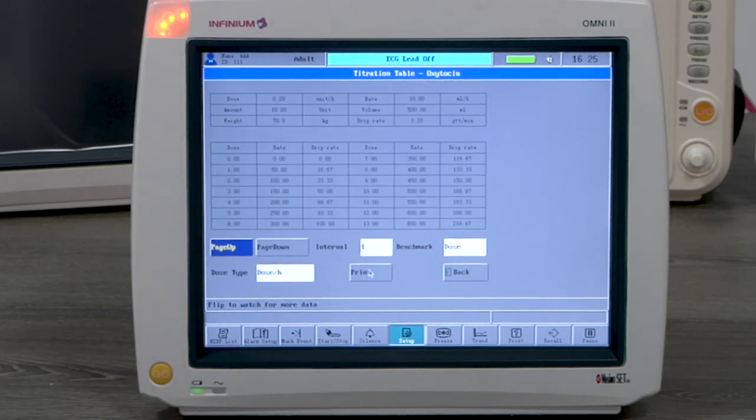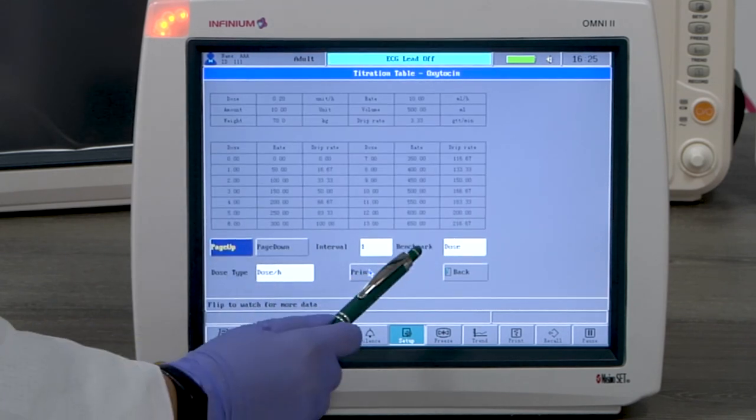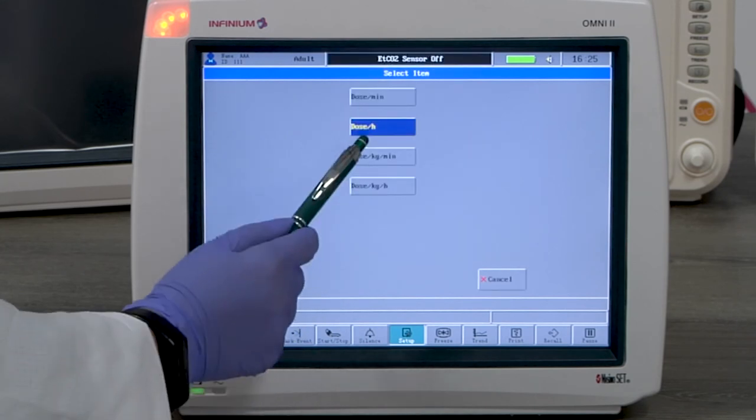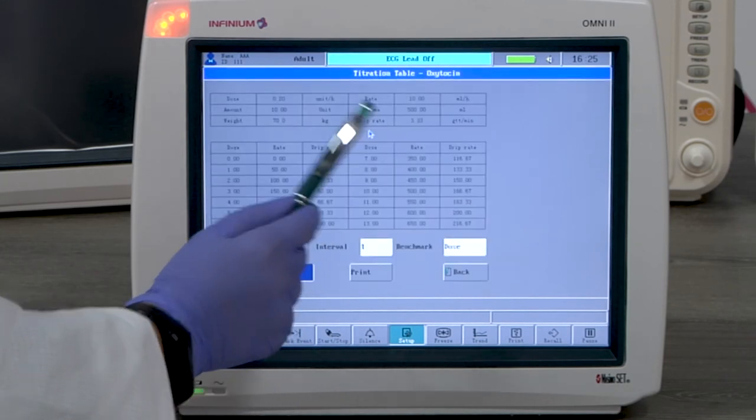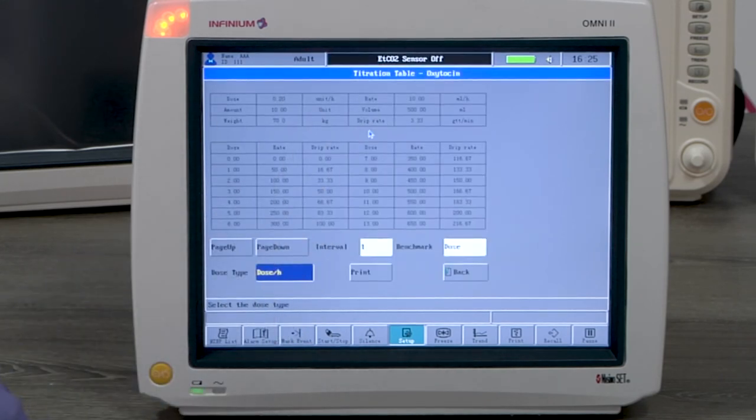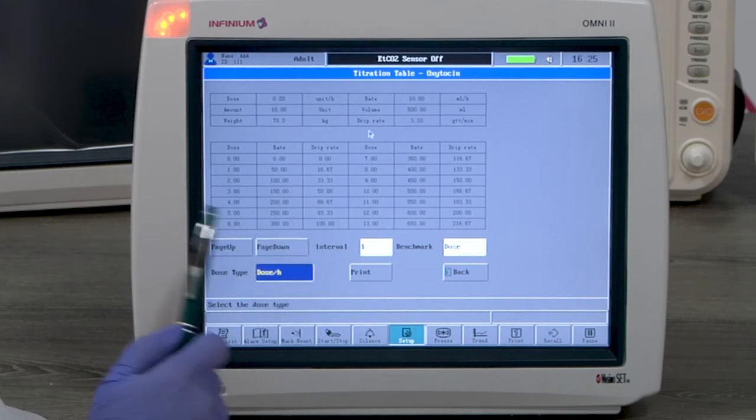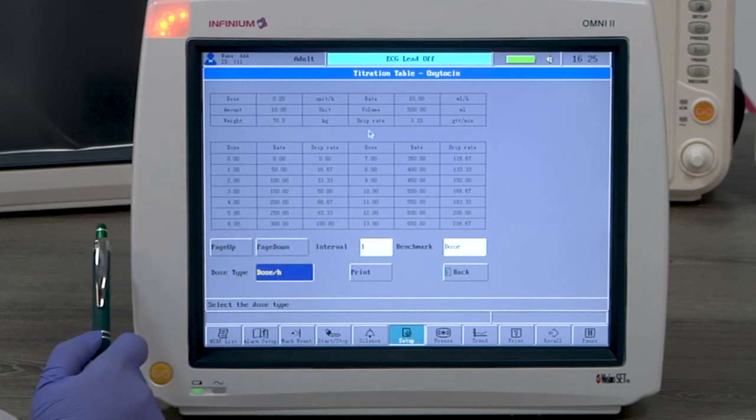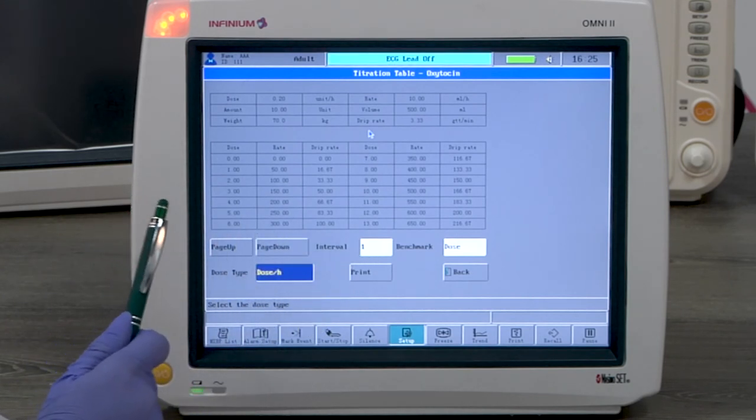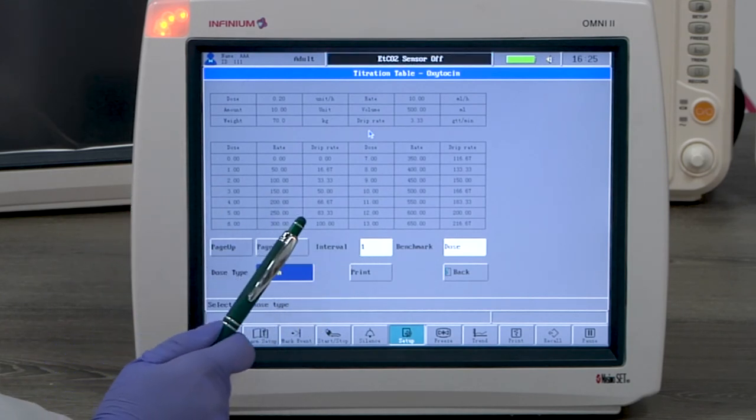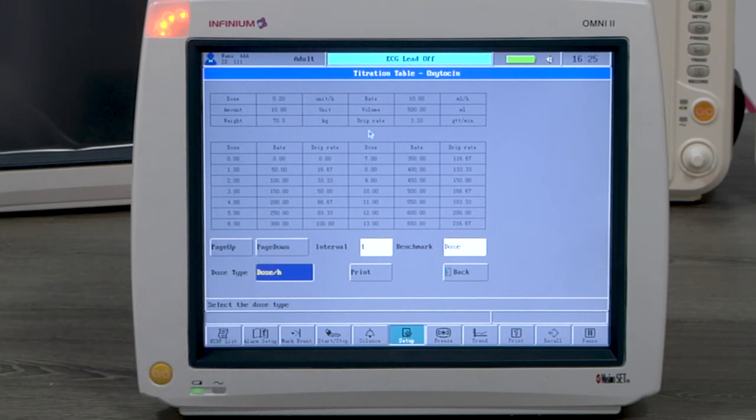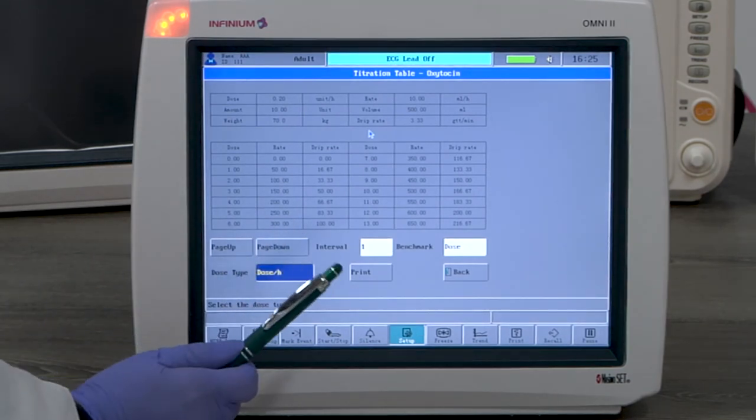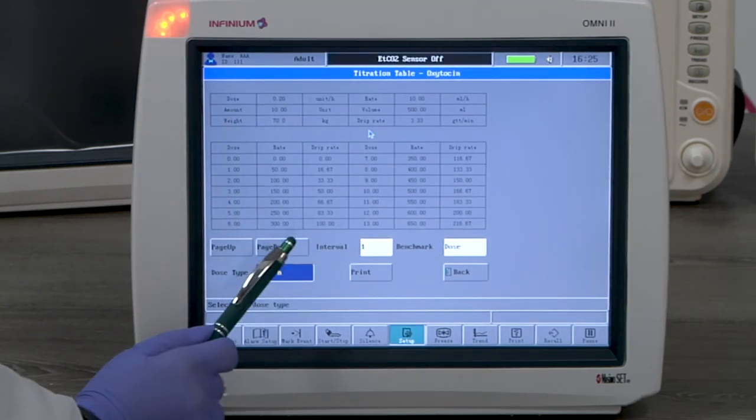Here you can select the benchmark, the interval, and the dose type. We have selected dose type as dose per hour. This chart lists the value of rate and drip rate under different dosages per hour. Select page down to see more results.